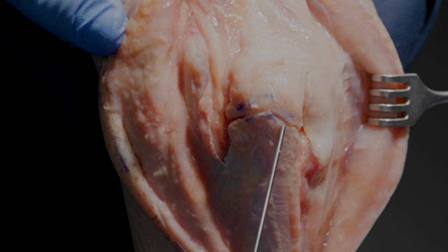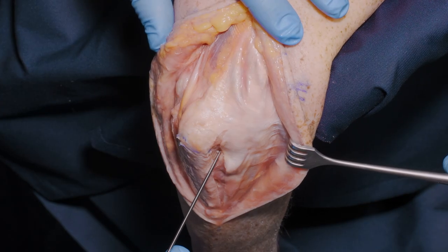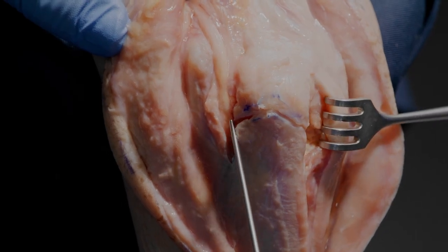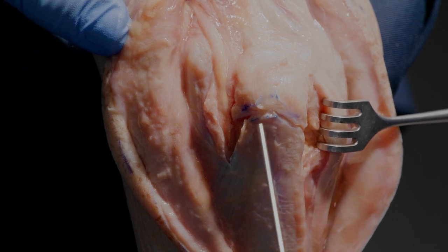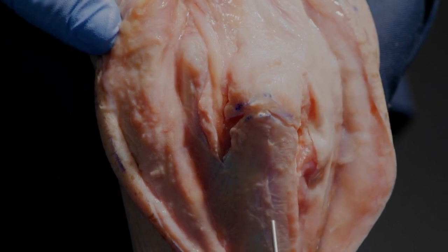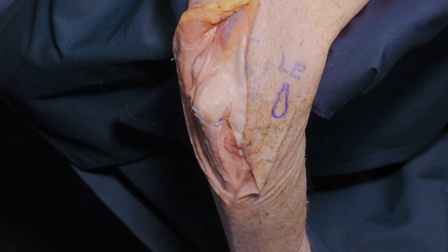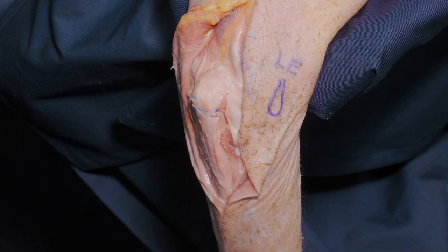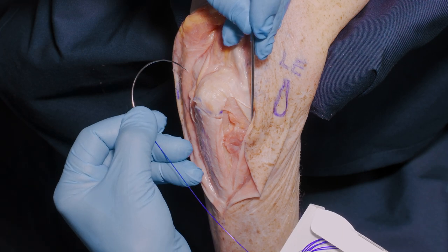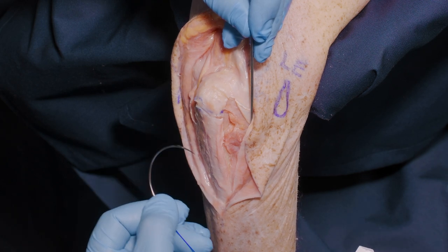We've incised the periosteum apex proximally so that the exit point of the osteotomy will be at the bare area of the olecranon laterally and medially, noting that it's very slightly asymmetric. Before proceeding, we need to plan fixation. What is commonly used is a standard olecranon plate. In case of poor bone quality, one might also use osteosutures through the tendon insertion and separate drill holes, more or less like the classic tension band technique.